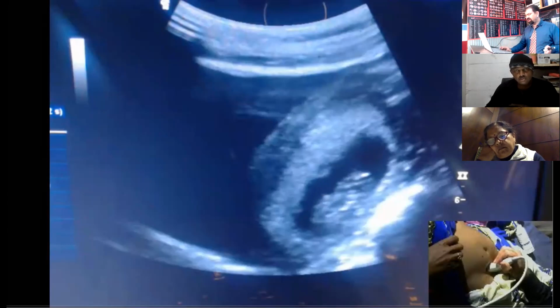How can we take 3 measurements when I am talking of the mean sac diameter? Mean sac diameter.